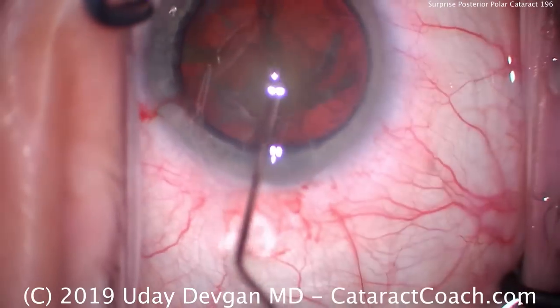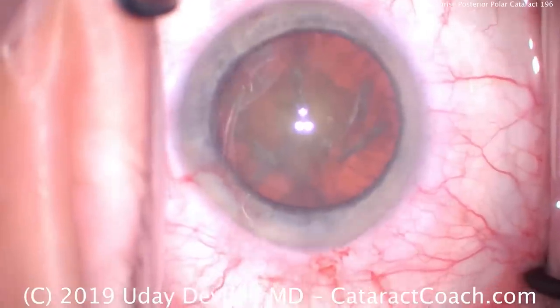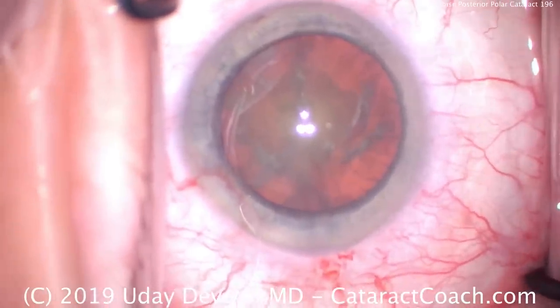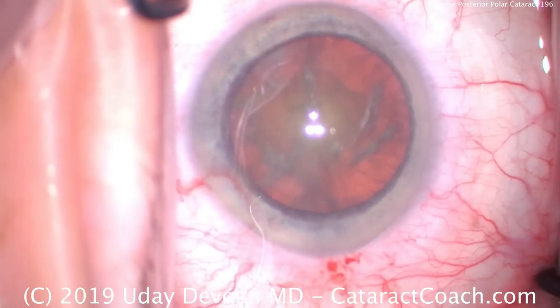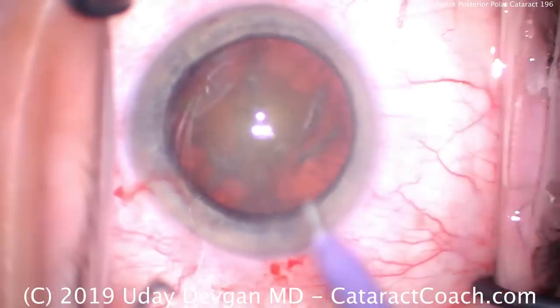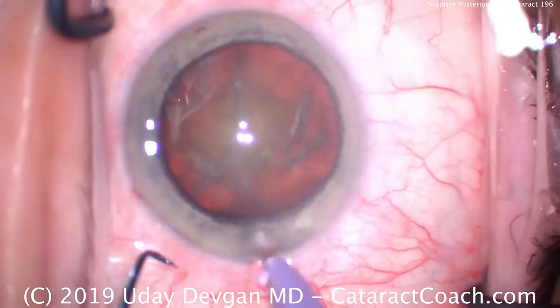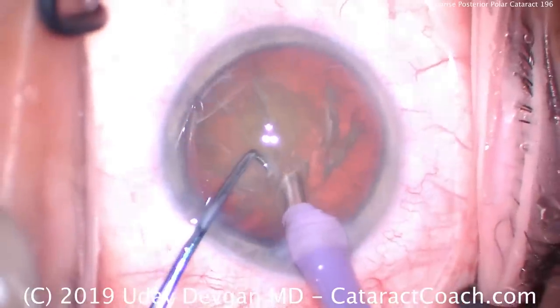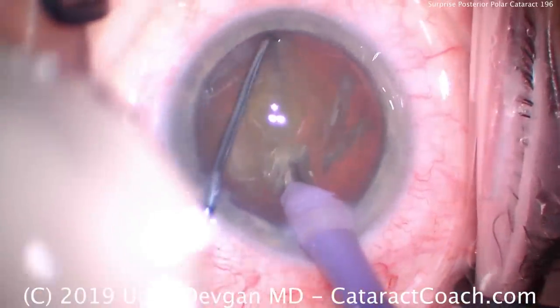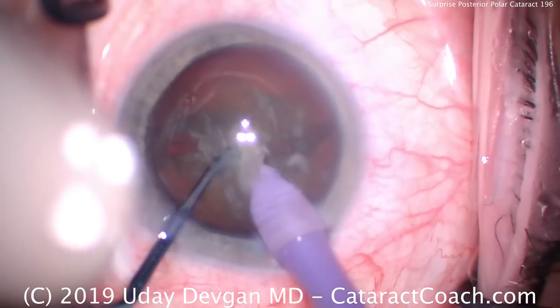There's a little bit of a plane I've tried to find. What we can do is get out this dense central endonucleus first, and we're going to do that with a chop technique. So we'll get the phaco probe, put it inside the eye, and chop this nucleus. Phaco probe going in, and we're going to buzz in, dig in the chopper, we'll get a nice separation. Now be careful separating the halves — just do a little bit. That should be enough.